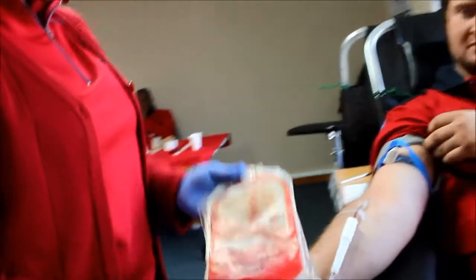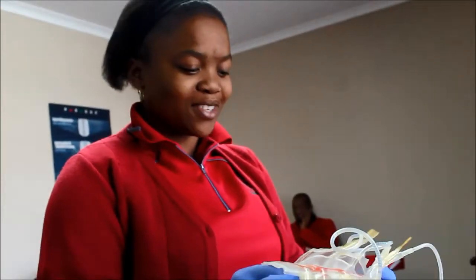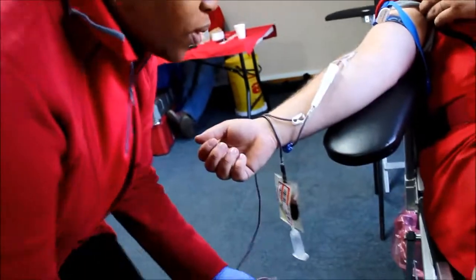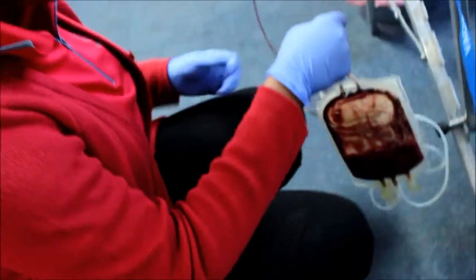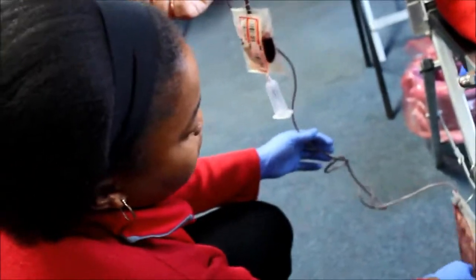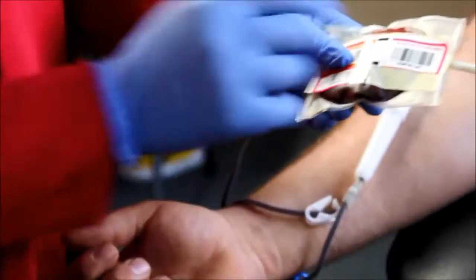The reason why there's three bags is because we separate the components. After taking the blood, it goes to the lab and that's when we separate them. That's why we say you're saving three lives at once with one unit of blood. Why do you need to separate the blood? Because you give it to three different patients with different conditions.